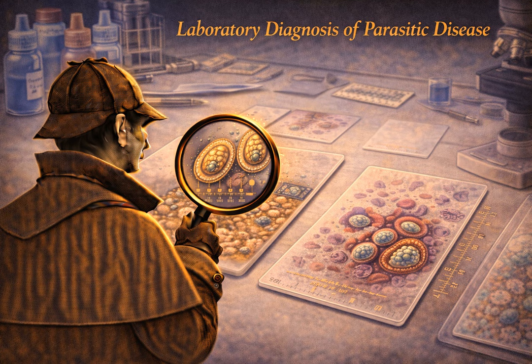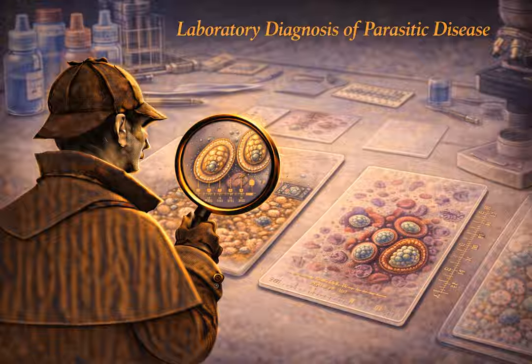And the absolute diagnostic gold standard here is ordering the thick and thin blood film. Why do we always need two different smears? Why not just do one good one? Because they answer two completely different clinical questions. The thick film is entirely about sensitivity. It answers the fundamental question, is there anything actually there at all?